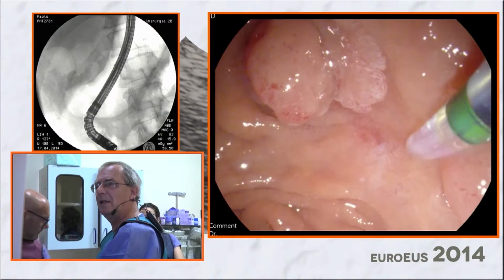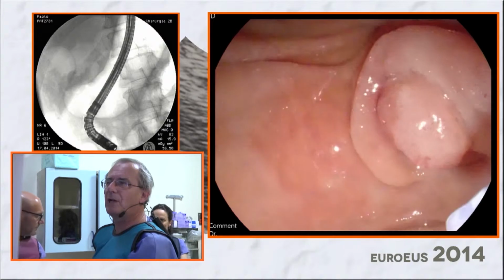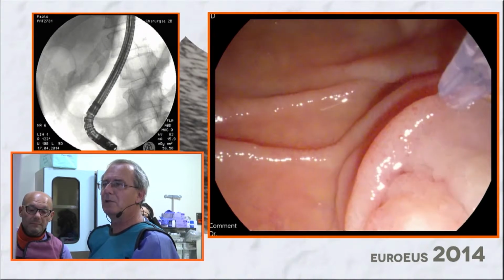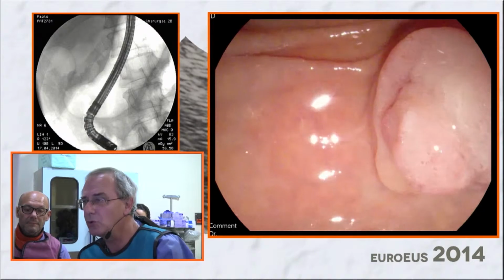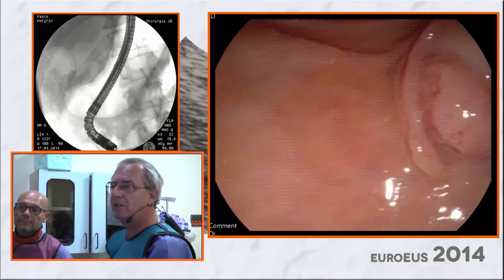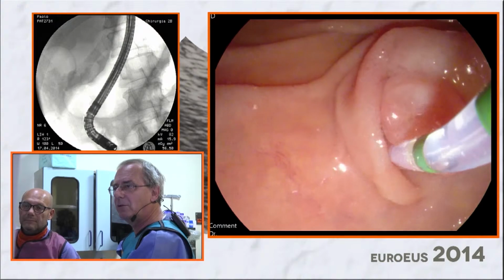You see, like an LST, a small LST. So I think I will try to catch everything together, because this is also adenoma here. So I will try to catch the whole papilla, but I'm not sure that once caught, this part will come completely off, but we will see. And just in case, we will do a second small resection of the remaining tissue.